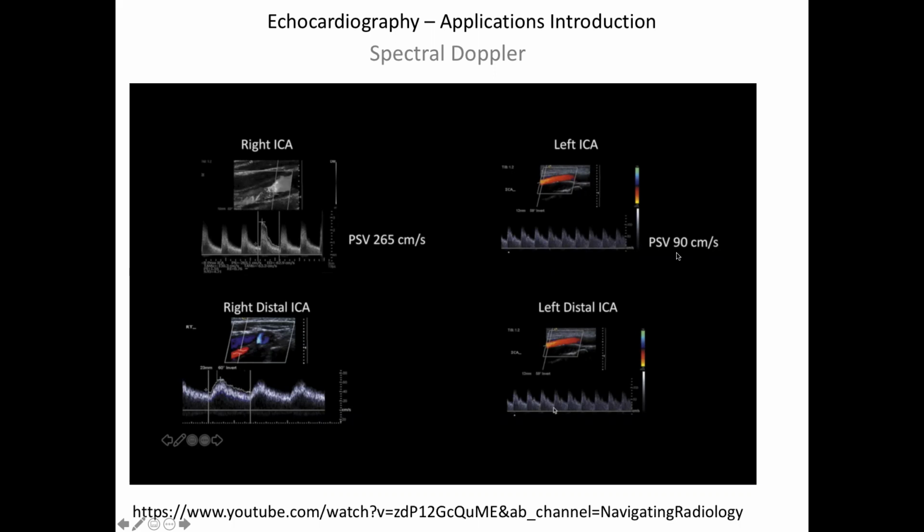So there's something going on the left side, but also the decay away here is much slower, right, than it is over here where the velocity drops down a lot faster. And so it's almost like it has some kind of resistance in it such that the decay has changed on that signal, right?